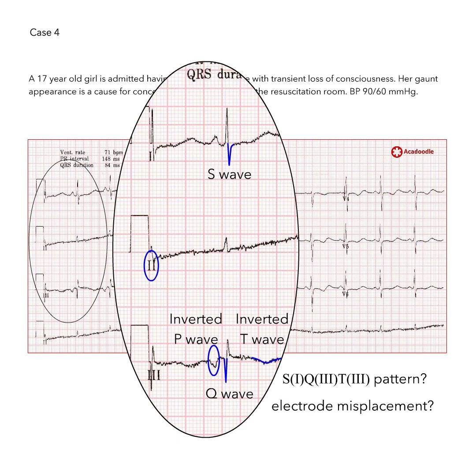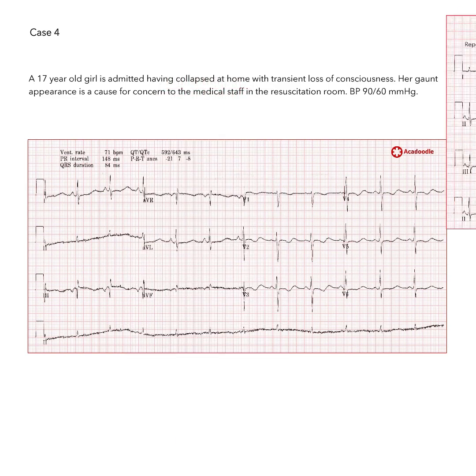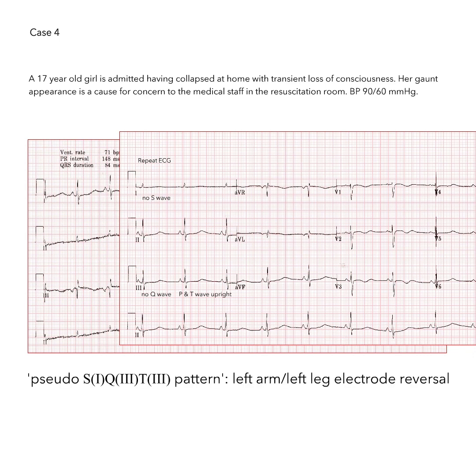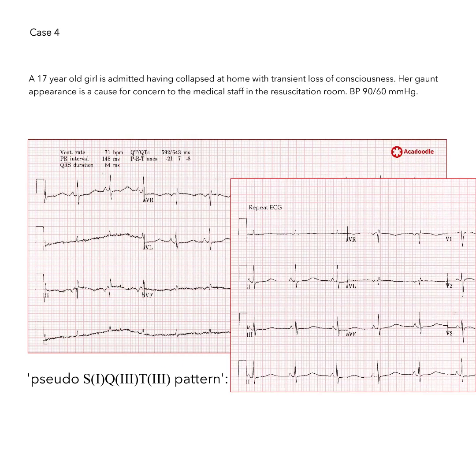The only way of being sure is to repeat the ECG paying careful attention to correct electrode placement. When we do this, in this case, we find that the abnormalities present in the standard limb leads on the index ECG are no longer present. This is a pseudo S1Q3T3 pattern, probably due to left arm, left leg electrode reversal.